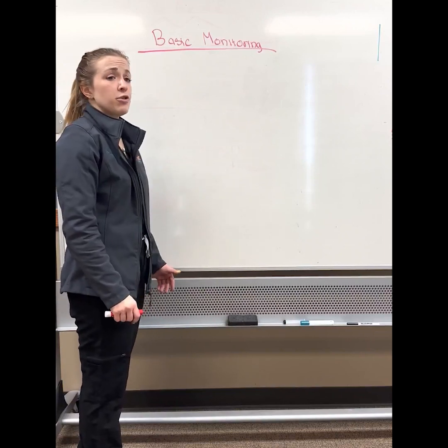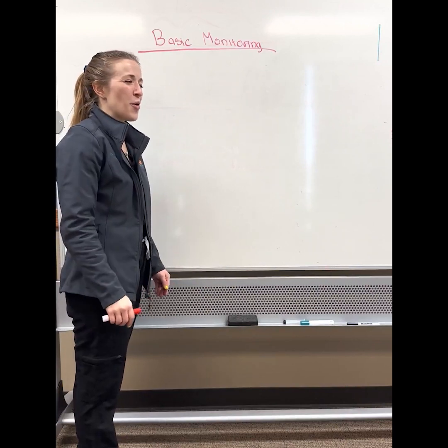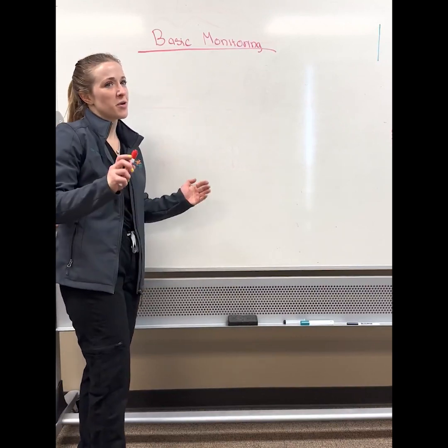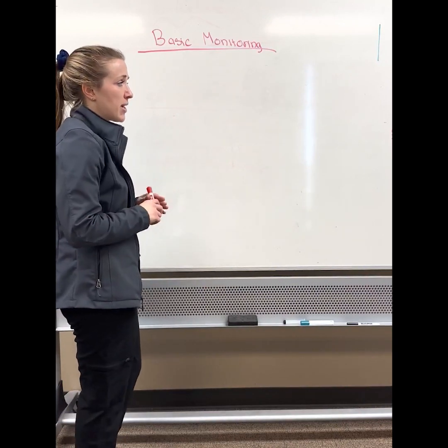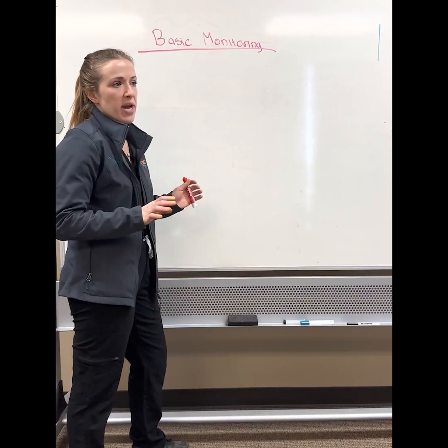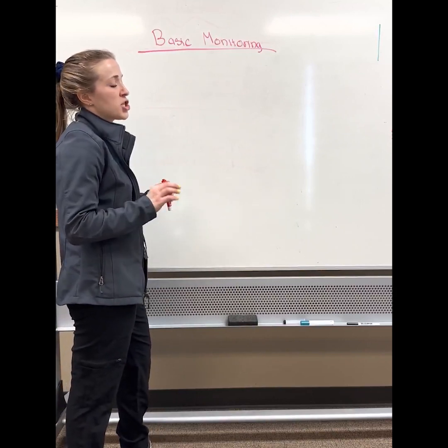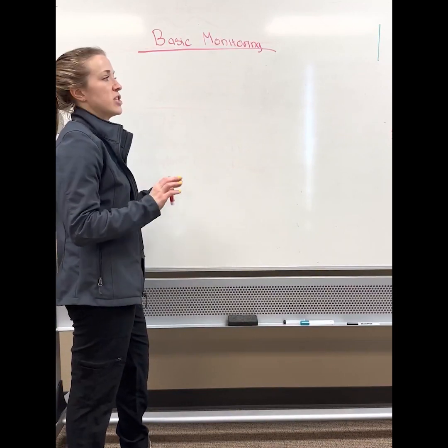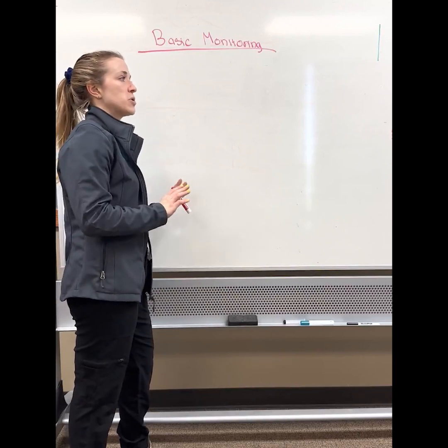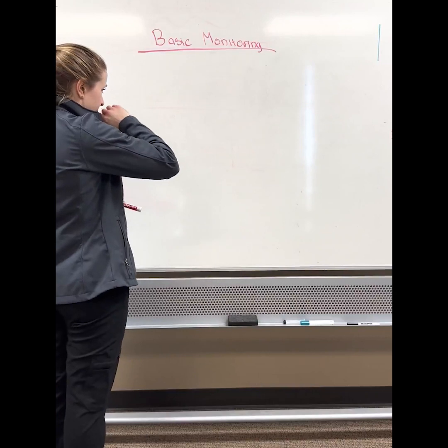The other thing is that if you move the patient and you disrupt the reading of the pulsatile flow, motion artifact will also give you an artifactually low pulse ox. So just keep that in mind. The pulse oximeter almost never reads falsely high, which is great. But that is basically how the technology works. So if the patient is still, if they're not vasoconstricted, you could probably assume that the pulse ox is reading correctly. So that's pulse oximetry.